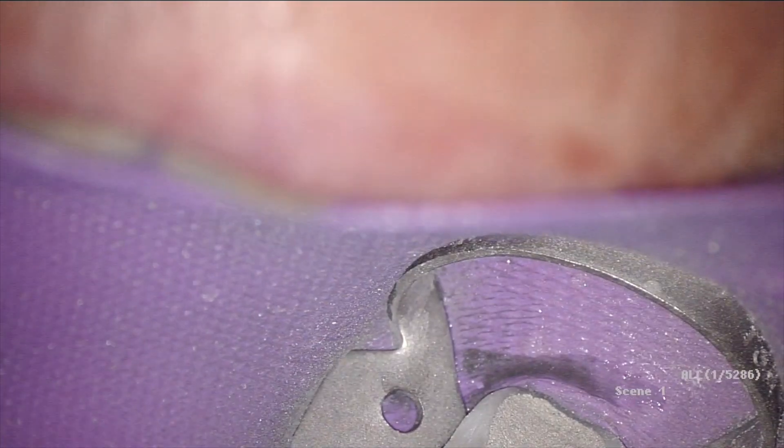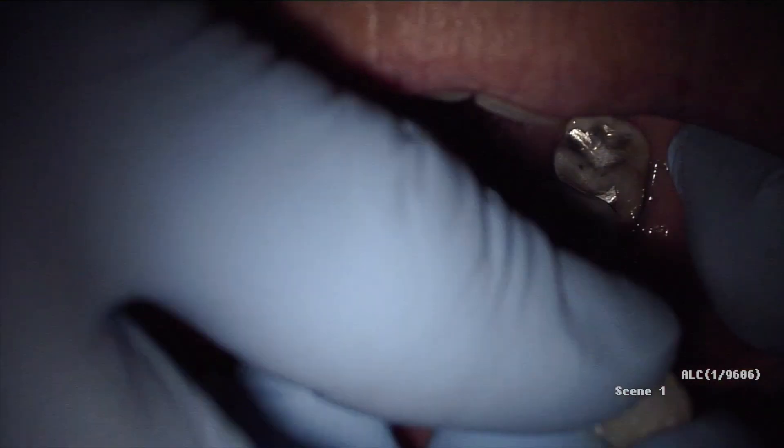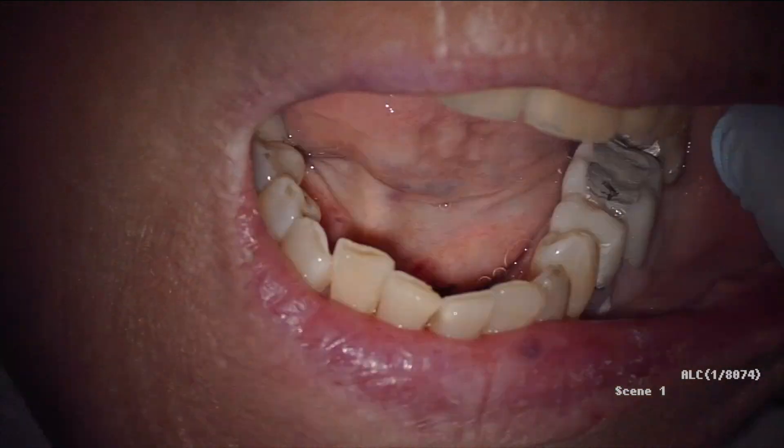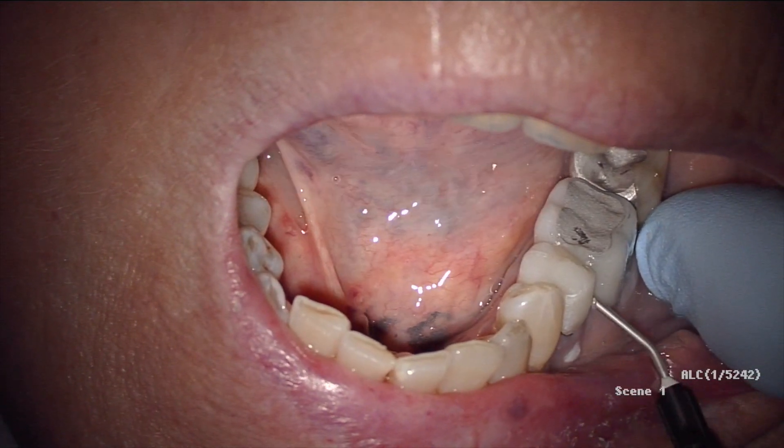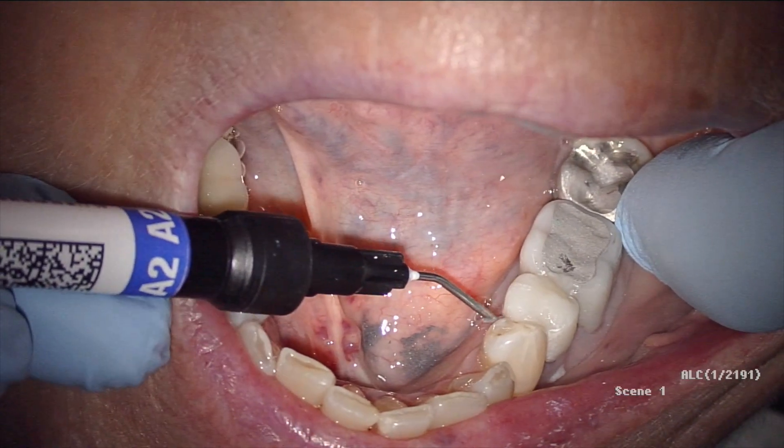Because you're wonderful listeners and you've made it all the way to this point in the video, we're just going to keep it going. We're just slowly making our way down. I was thinking about switching to a smaller Munce bur, but then we made it right down. You'll see a little bit of pink, and then that's it — we're good. So I sped it up because it was getting kind of boring. You can see not actually the pink — there's a very subtle pink — but what you're looking at is just the cement of the carbon fiber post, and I left just a little covering of it. After placing some temp bond and a little bit of Cavit in the top of the access, we just re-cemented that crown. Had the patient bite down and she was good.